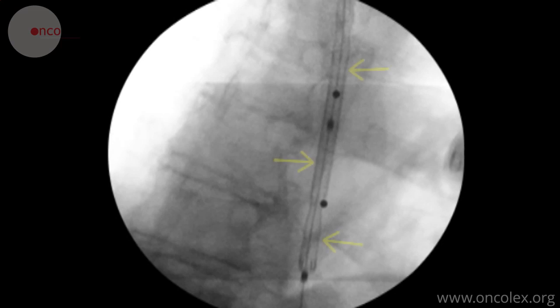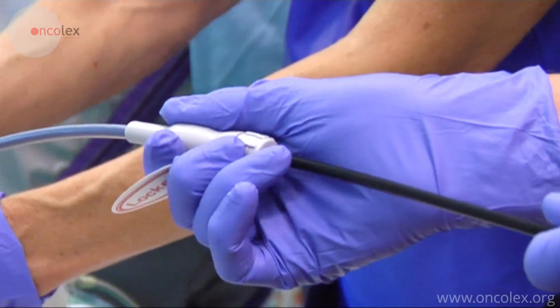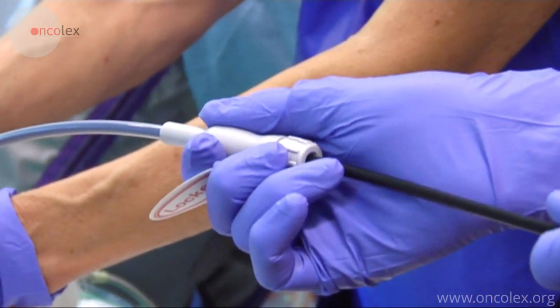The outline of the catheter is visible on fluoroscopy. The stent is aligned with the two lead balls, then released, and the catheter is removed.